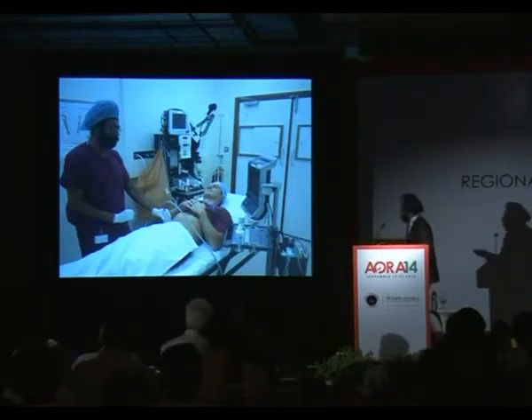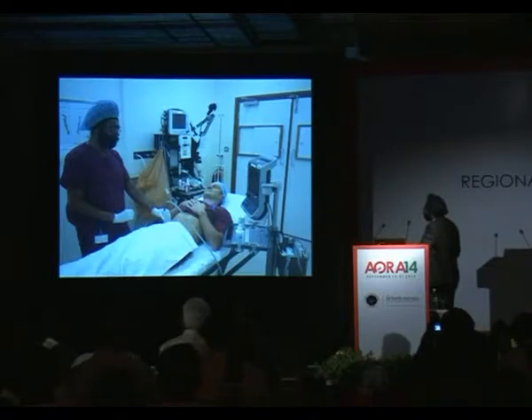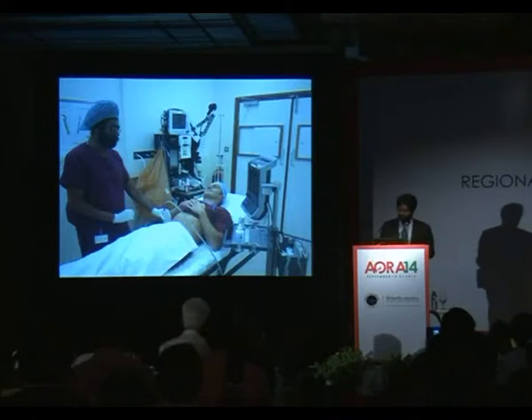That's our new fellow. So if I'm doing a right-sided fascia iliaca block, I'll start with a linear transducer, a high-frequency transducer, set at a depth of about 3 to 4 centimeters. My eyes, the probe, the needle coming from here, and the machine, they are all in one line. That makes the technique easier.